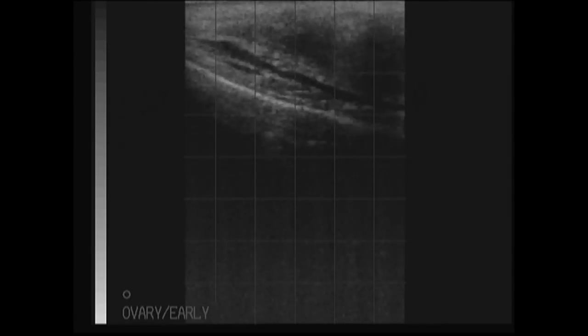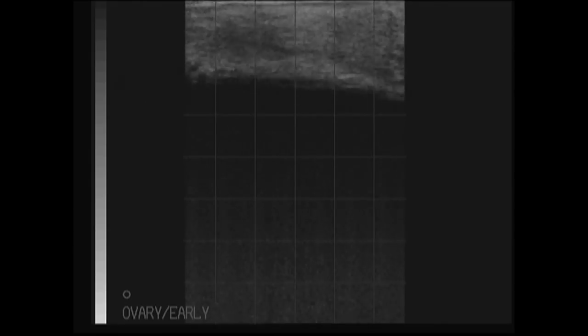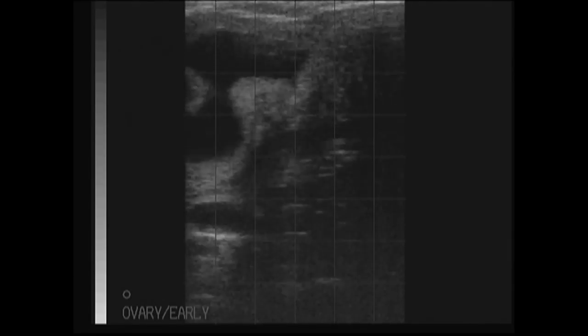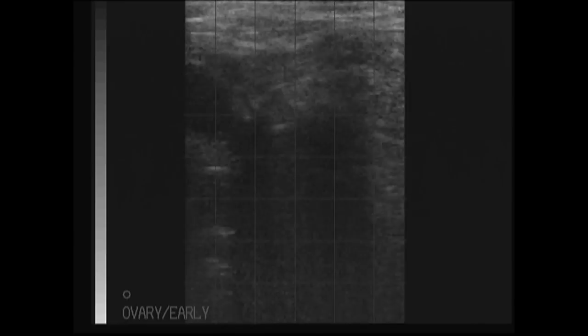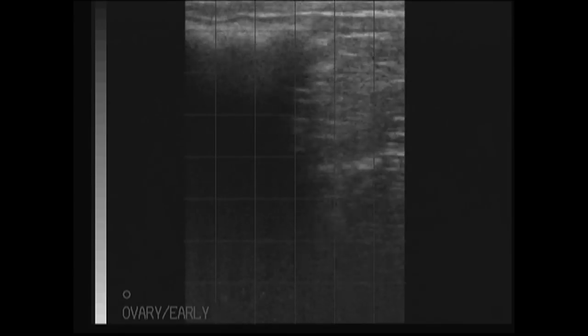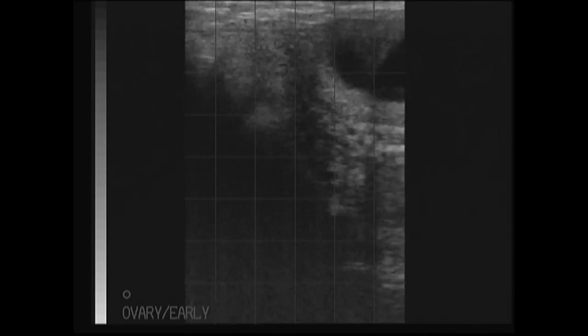The ultrasound probe is now being pushed further cranially, towards the head end of the cow. We are looking to identify the uterus, and in this pregnant cow we can see tubular structures filled with anechoic or black fluid — and there they are. They are quite prominent, indicating this cow is pregnant. The fluid within the uterus is anechoic or black, without indication of particulate matter.